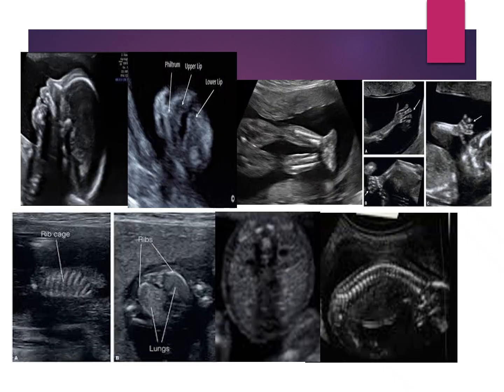In this first image I have here, you can see this would be considered your profile. So baby's face is up, we can see the skull wrapping around, and we can see this nasal bone. This nasal bone needs to be in this image, okay, because we'll actually measure this nasal bone. If you ever work in like an MFM site, this nasal bone will get measured. It's also going to show us the maxilla here, those bones inside of the mouth, as well as the lips and the chin. So this is the profile, that is what you want to get.